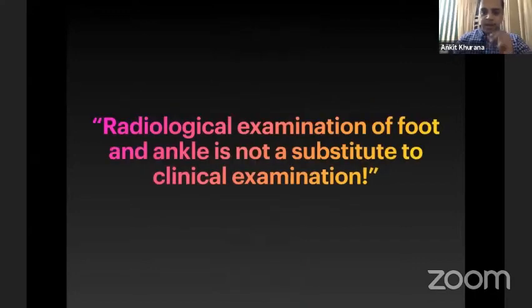Before I begin, I would like to say at the outset that radiological examination of the foot and ankle is not a substitute for clinical examination at all. The clinical examination should always precede radiological examination. And again, I should reiterate that it is not a substitute for clinical examination. One should have a thorough clinical examination before going on to doing a radiological analysis of the foot and ankle.